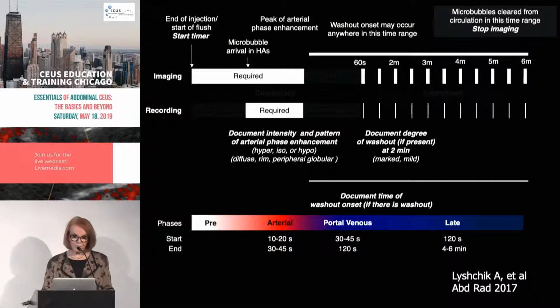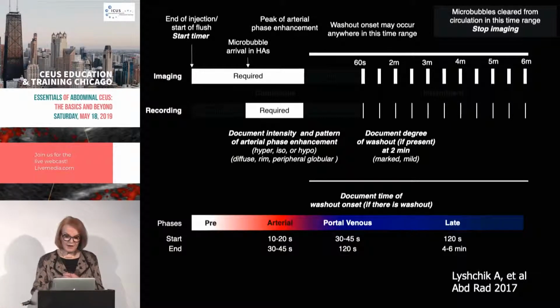And this is the graph which Richard mentioned. Andre Lyshuk and I are both on the LIRADS working group, and this is something that we made for that. What we're talking about here is, you can see on the left side, I don't have my mouse working for some reason, the line that says recorded. What's required for us to record is we always put on our record button right when we see a bubble in the field of view. And then you want to leave it recording until you're past the peak of the arterial phase. Not a long ways past, but usually our clips are somewhere between about 10 to 15 seconds.